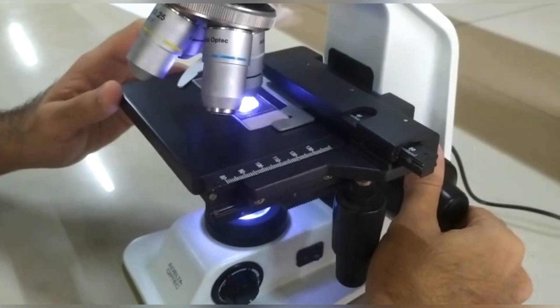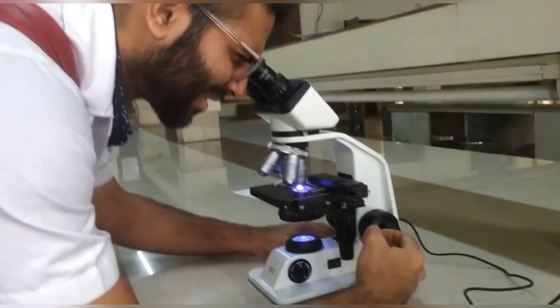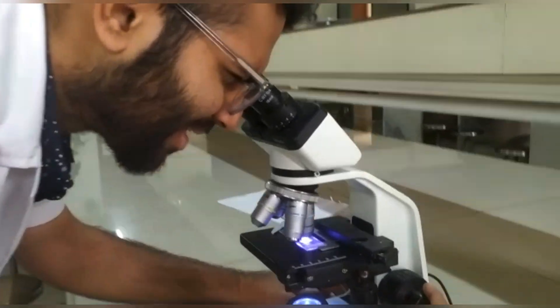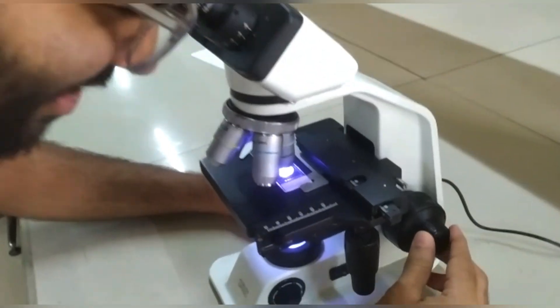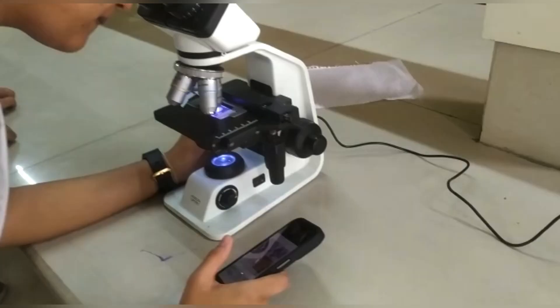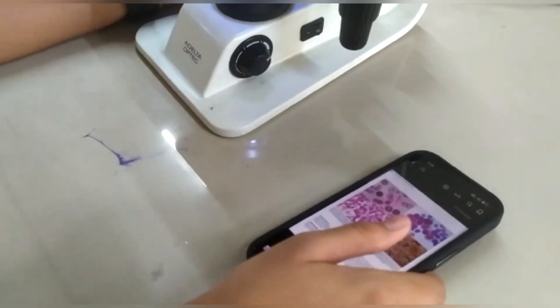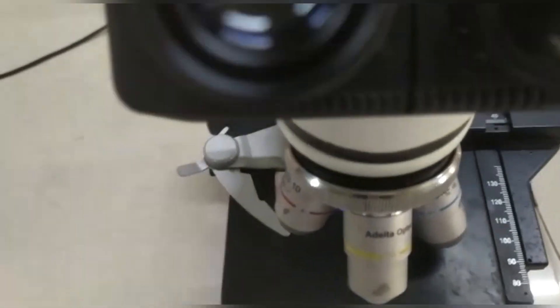When examining tissues or cells, it is essential to create a thin slice that can be viewed under a microscope. A slide is a thin piece of glass with a tissue or cell sample on it. By placing the slide under a microscope, we can examine the sample at high magnification and observe the characteristics of the cell.